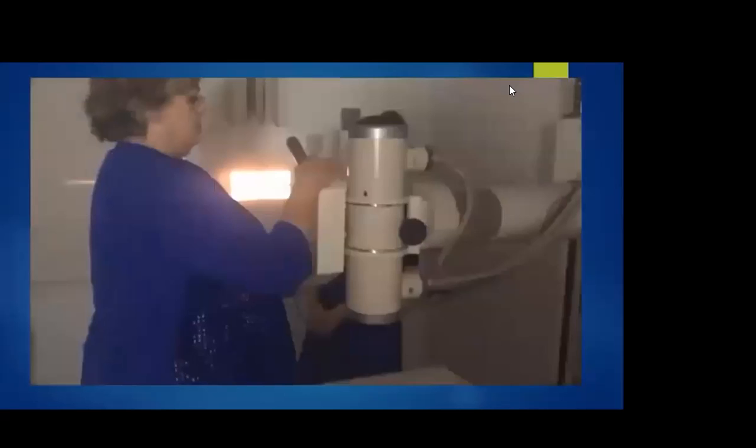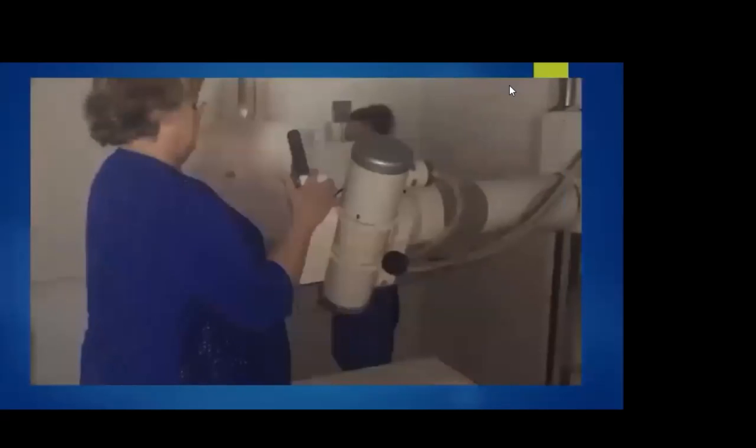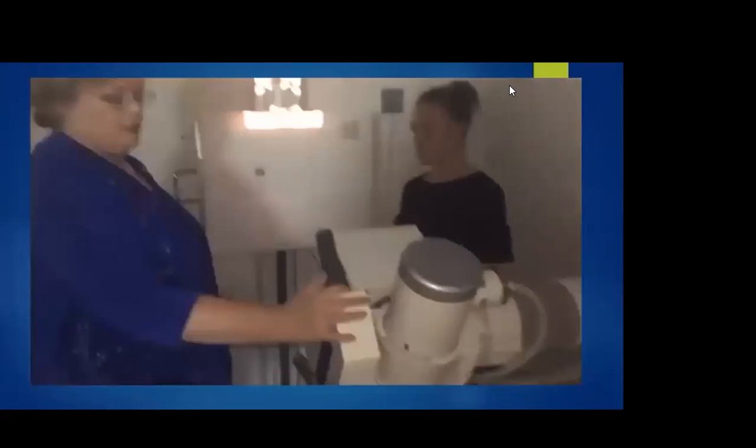I'm going to do an axial with that angle. She's probably going to need a stool to stand on. She's a little short.